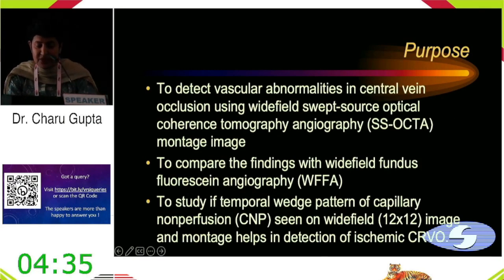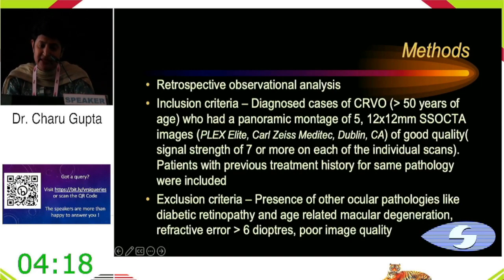So the purpose of the study was to detect vascular abnormalities in CRVO using wide field swept source OCTA, to compare the findings with wide field fundus angiography, and to study the temporal wedge pattern of capillary non-perfusion seen on the wide field 12x12 image, and the montage helps us to detect ischemic CRVO. So it was a retrospective observational analysis.